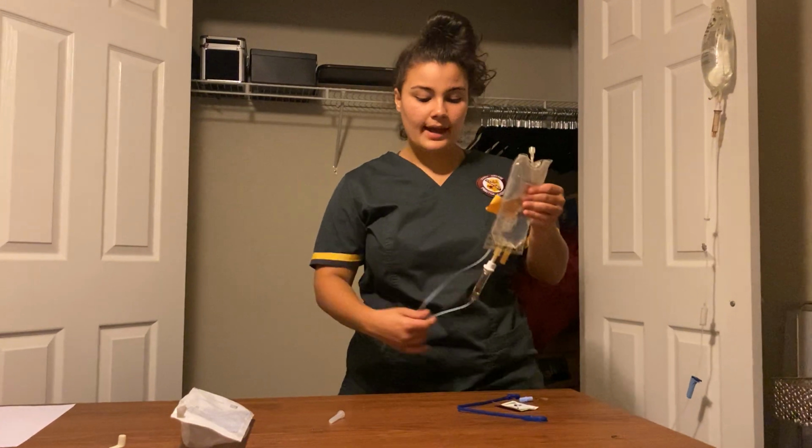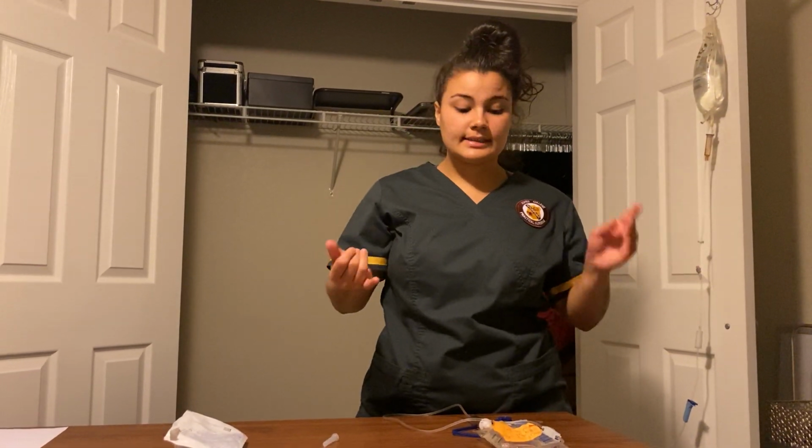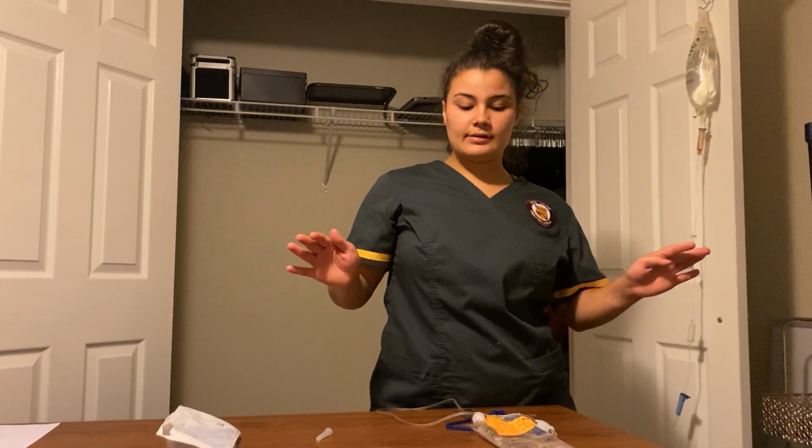Then after I do that, I will wash my hands, perform hand hygiene, and document. What I'm going to document is the time of administration. I'm going to put my initials in the appropriate box, and sign my signature on the bottom of the MAR. And that is everything to administering a piggyback medication.